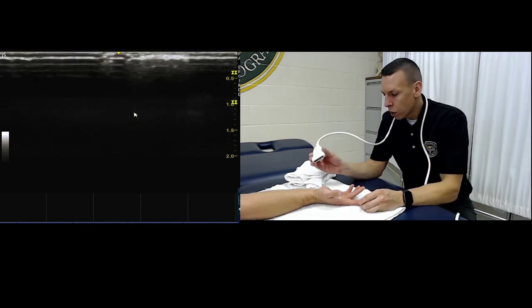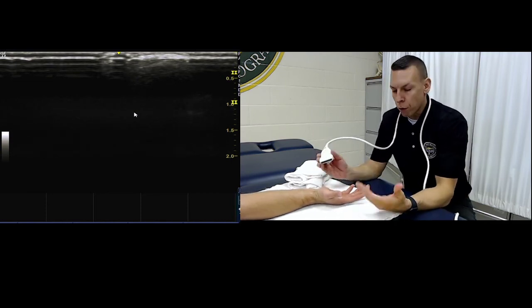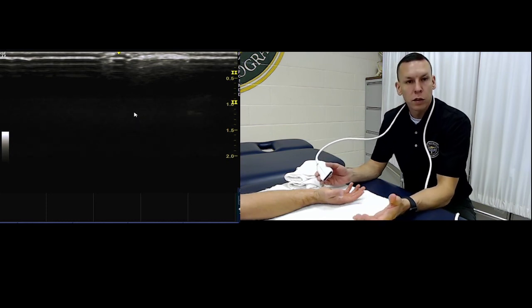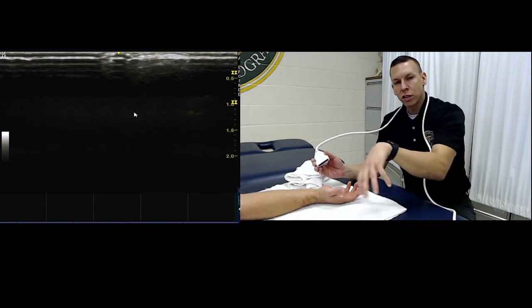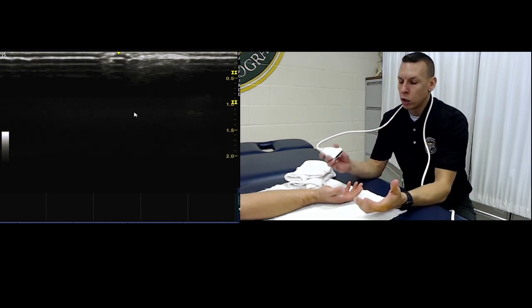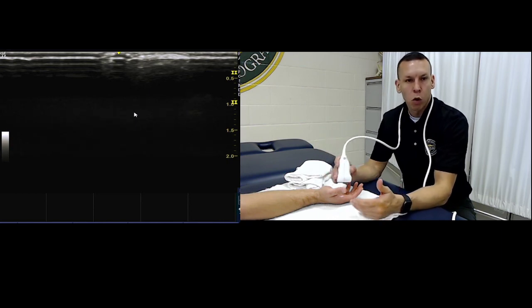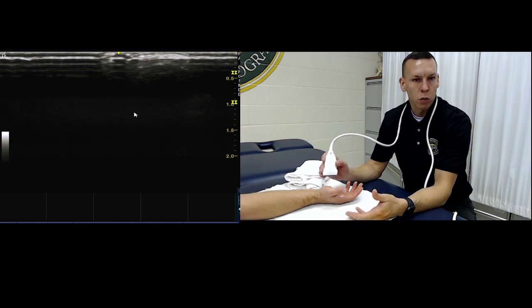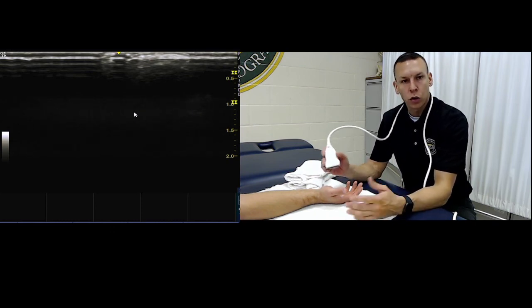Good. Okay, so with the wrist and hand, if someone has an acute trauma, the other thing you can do is put them in a water bath. If you have a basin of water, you can do a completely non-contact ultrasound and just have the probe close to the hand without touching it, as they're submerged in water. That can be a great way to look at very small structures in the wrist and hand.